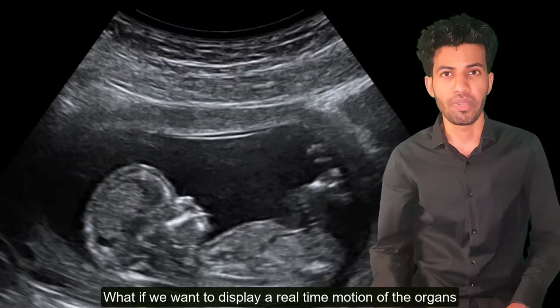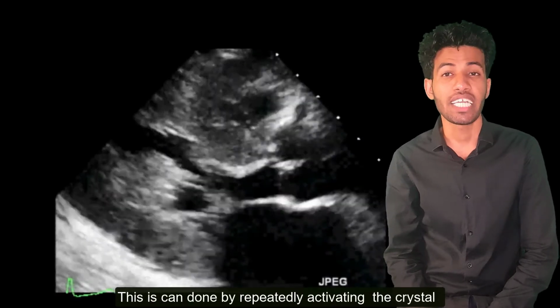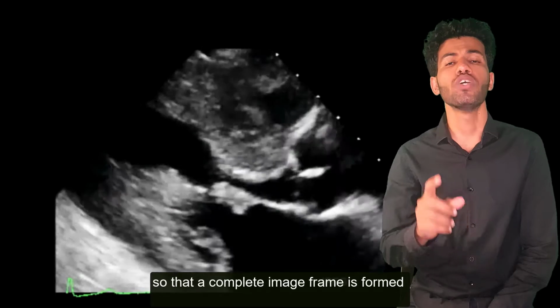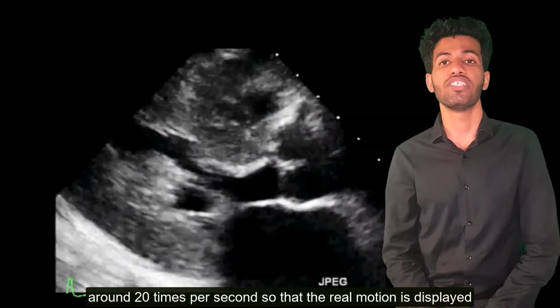What if you want to display real-time motion of the organs? This can be done by repeatedly activating the crystals so that a complete image frame is formed around 20 times per second, so that the real motion is displayed.